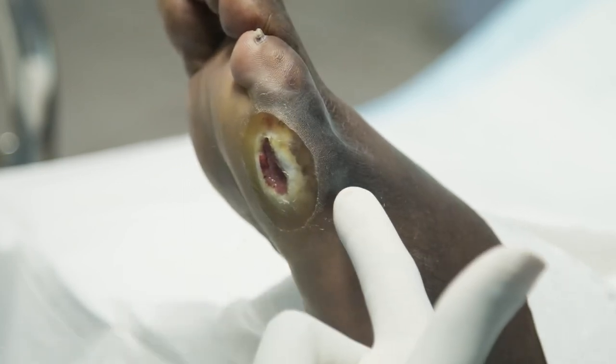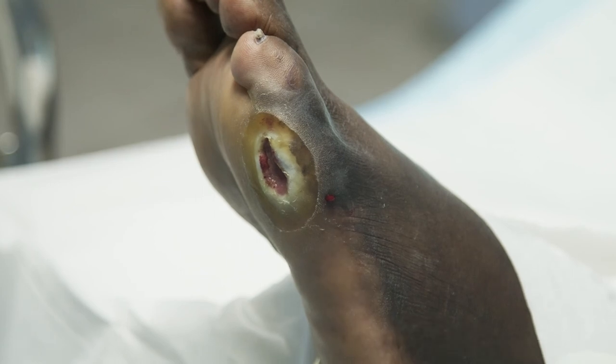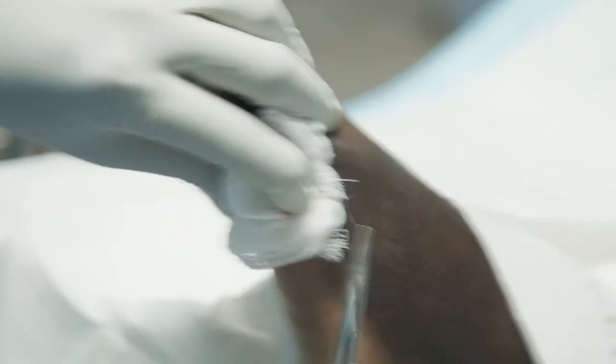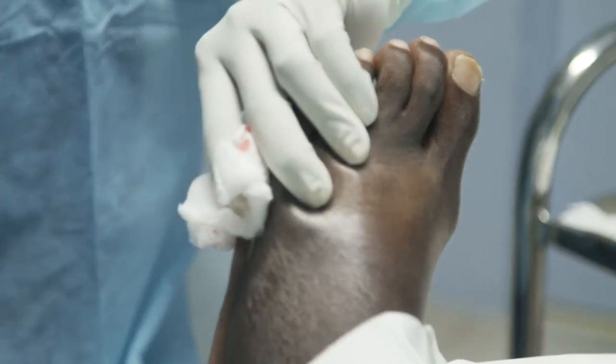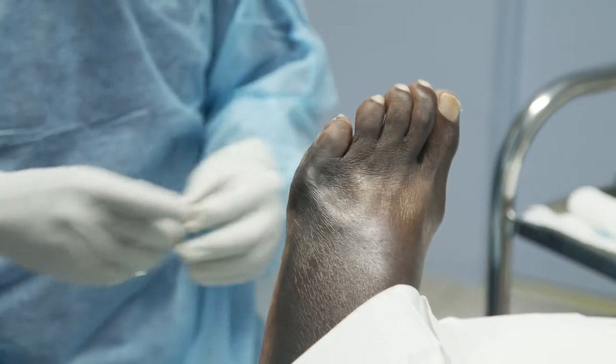Okay, so we're in the joint. That's the angle we're going at. The angle of attack here is very important, because I know the bone comes like this, and I'm wanting the bone to sit straight. Yeah. That's a good angle. That's a good spot you're at. That's a great spot, actually. That's good. You'll be able to catch it from right there. Okay.